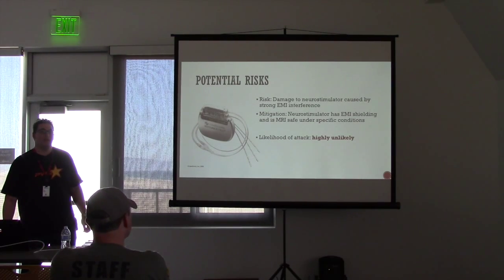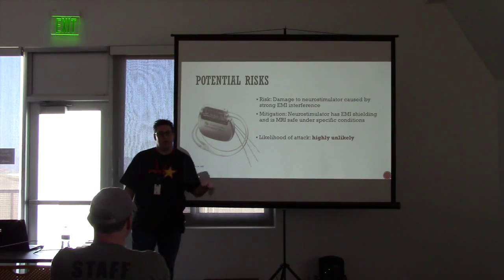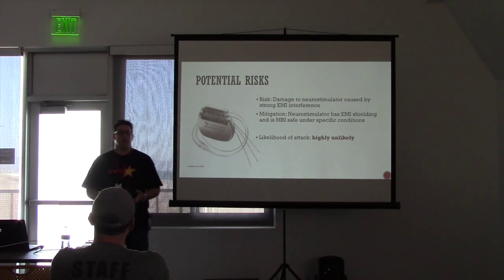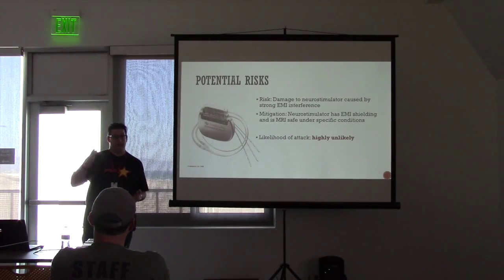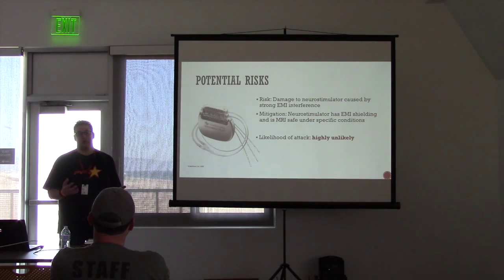Is there any effect, like microwaves with the magnetron inside, that can actually send out concentrated waves? Yeah, that's a good question. When it's put in MRI mode, it actually shuts the device down, so it can't be sending the waves through. From an actual wave standpoint, it would change the waves of the pain management pulse. What about even dead circuits, which can actually still conduct electricity?